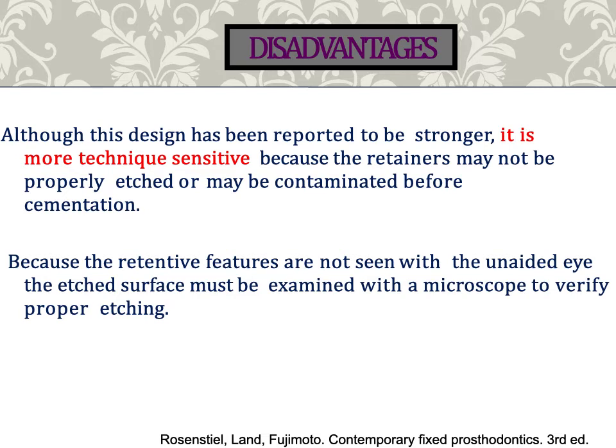Disadvantages of Maryland bridge are that although this design has been reported to be stronger, it is more technique sensitive because the retainers may not be properly etched or may be contaminated before cementation. Because the retentive features are not seen with the unaided eye, the etched surface must be examined with a microscope to verify proper etching.